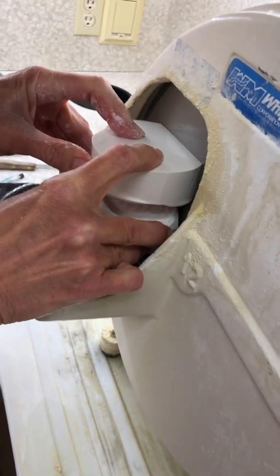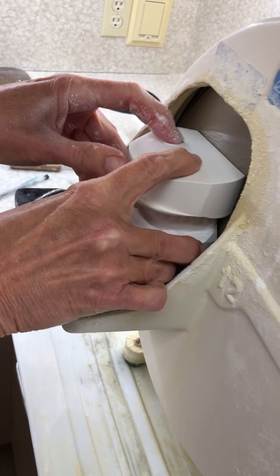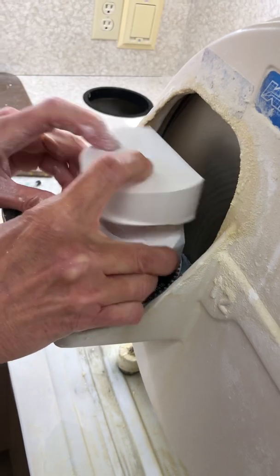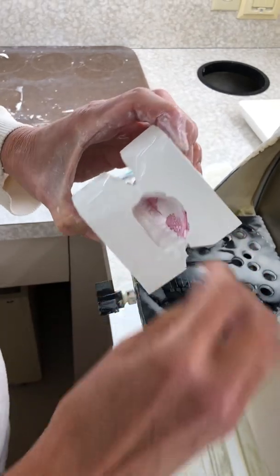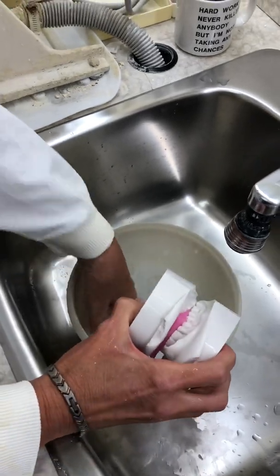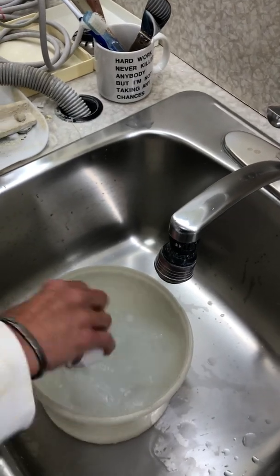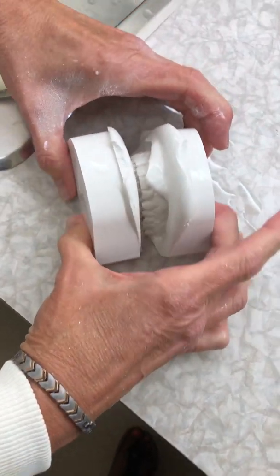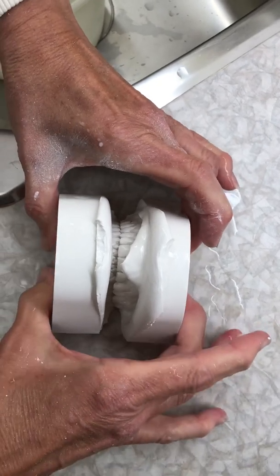Okay. And you'll know you're done when all your scribing is done. Now we're really close. There. So now we know that that's leveled off. I'm just going to rinse this again. Now, just to make sure that there's no tipping or anything, let's just set it on the table. And when you push that together, there should be no real flex moving around there. It should be solid, and it is.